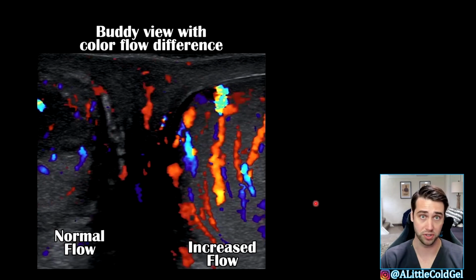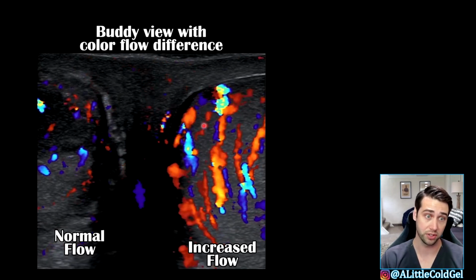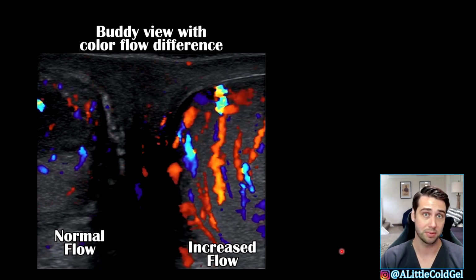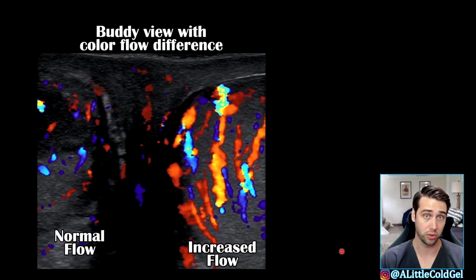We'll just mention this briefly, but you may also see something like this, which is increased color flow in one testicle compared to the other. And that can be a sign of something called orchitis. And like I said, it's not really something that you need to diagnose in the ED. Torsion is what we're really worried about.